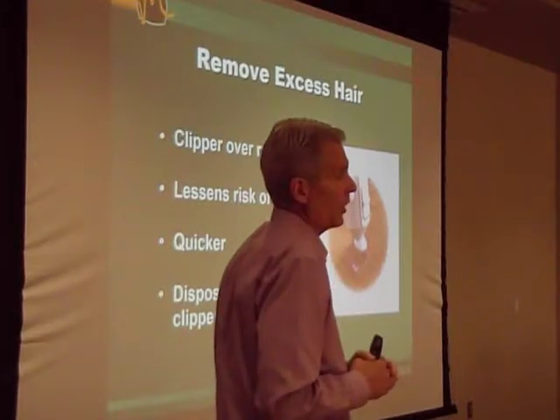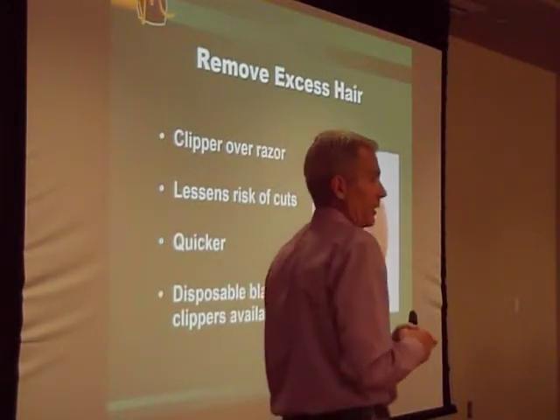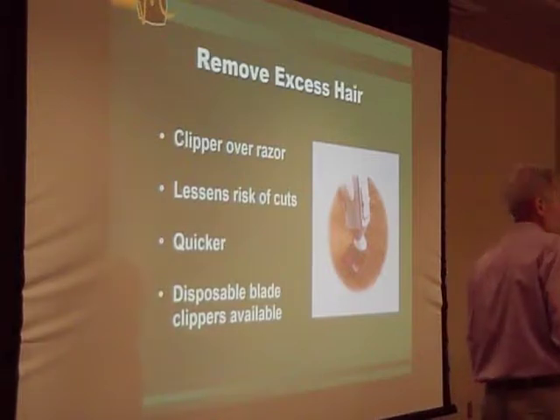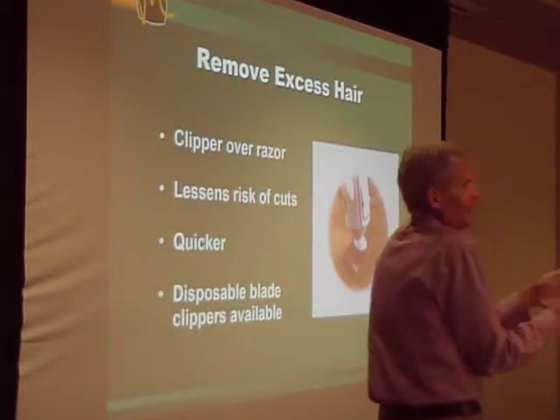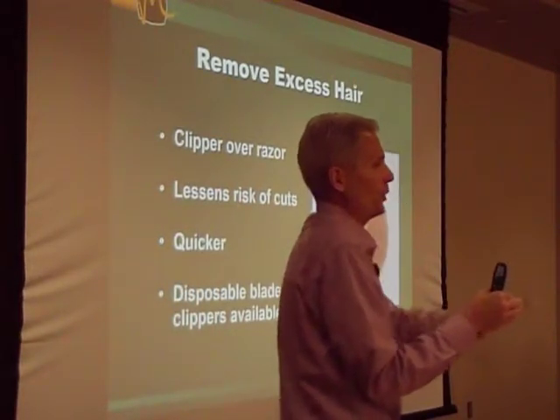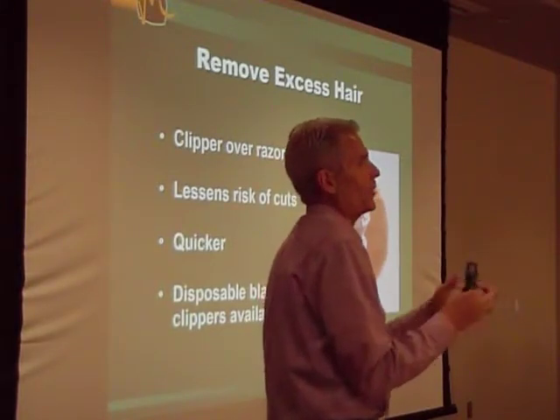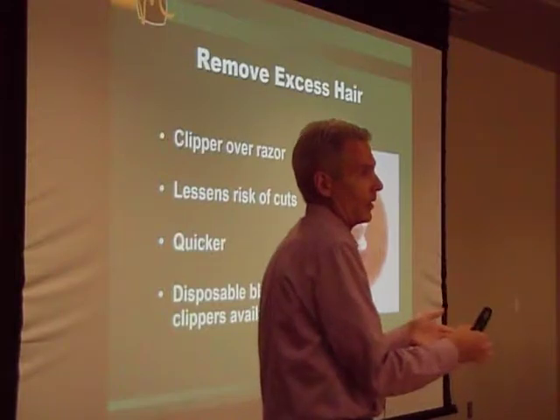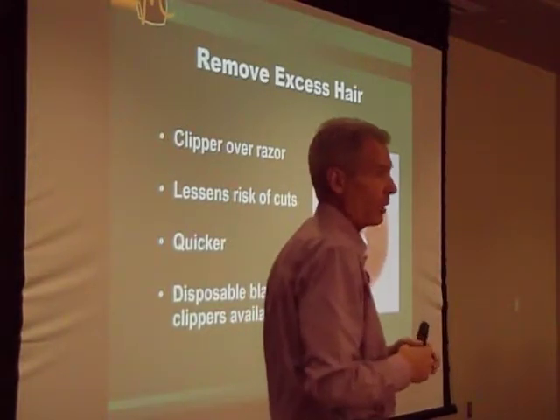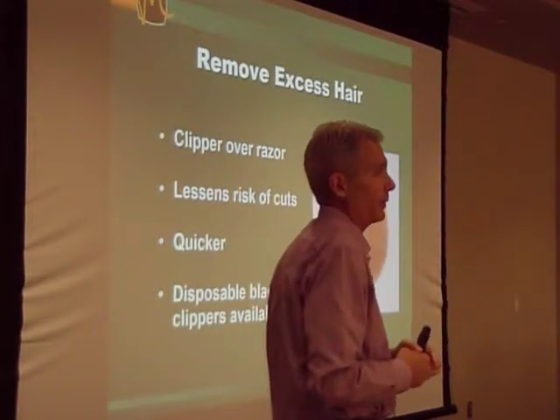I will tell you, years ago, and maybe Barbara remembers this trick, a lot of EMS agencies used to carry Arid Extra Dry antiperspirant because it did an excellent job of stopping diaphoresis in the area where you're putting your patches on. The only problem, it had a lot of talc and powder in it, and if you really coated the skin, that actually reduced your ability to capture a signal. But that's still a trick that can be used. That stuff might work. I'm not that familiar with it.